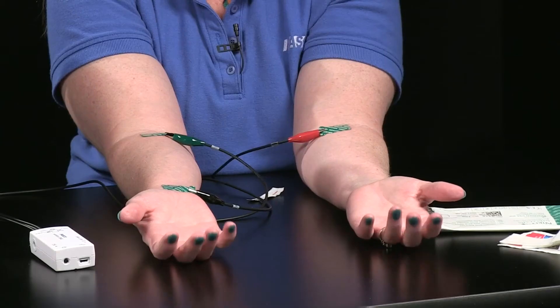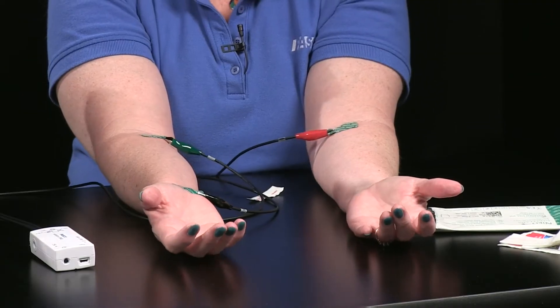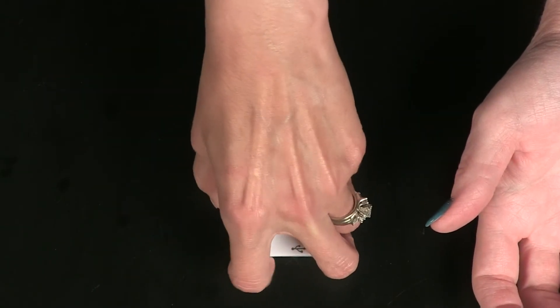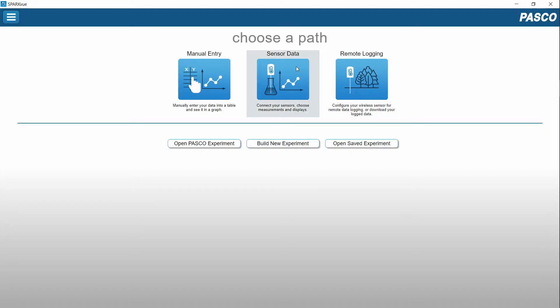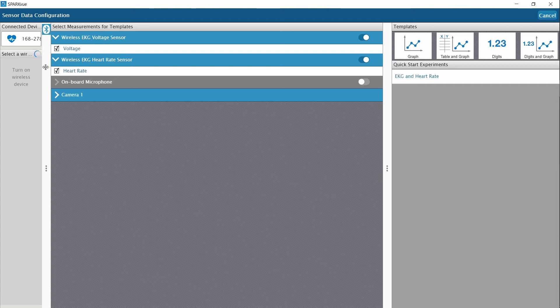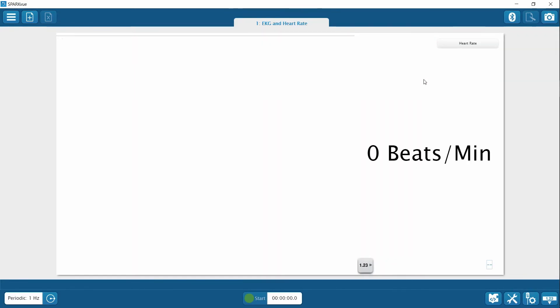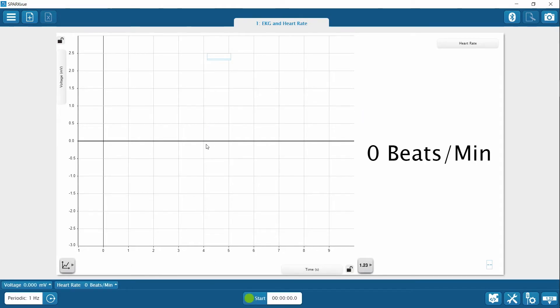Be sure the clips are making the most contact possible with the conductive tabs. We're almost ready to collect data. The test subject should be seated away from the data display or they can close their eyes. Palms should be facing up, legs should be uncrossed, and the subject should be totally relaxed. Now I'm going to connect the sensor to SparkView. Notice when I connect the sensor, a quick start experiment becomes available, so I'll choose that for my data display because it will show the EKG waveform as well as heart rate.